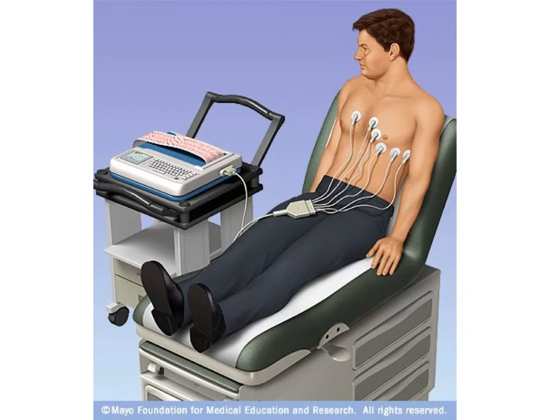Here is a picture of precordial lead placements in a patient. As you can see, this would be V1, V2, V3, V4, V5, and V6. So all these are located around the heart, and they are able to give us electrical activity information from the heart from different angles.